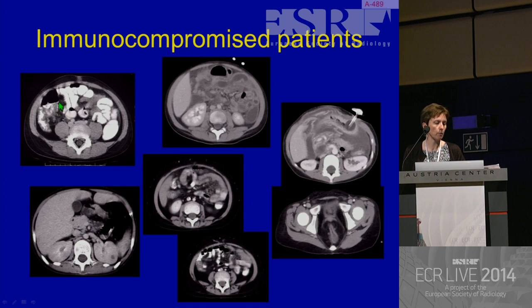So Simon showed you a lovely example of ultrasound. This is quite an old example, but this is what typhlitis or neutropenic colitis looks like on CT. These are fungal abscesses. Again, you can see these on ultrasound, but occasionally we're asked to evaluate whether there's fungal lung parenchymal disease or fungal infection involving Waldeyer's ring, because the severity of disease will affect the treatment and how long the children go on for it. We have graft versus host disease. Again, certainly ultrasound, if you can do it, would provide you with information. You may not need CT, but occasionally we do. You can see all the fluid and the bowel wall edema.